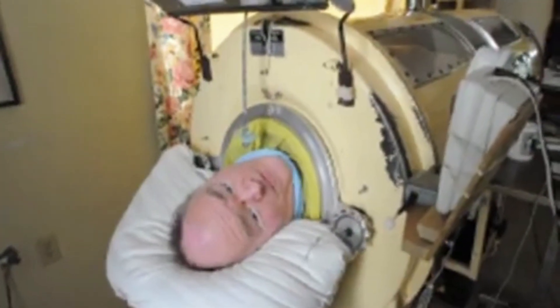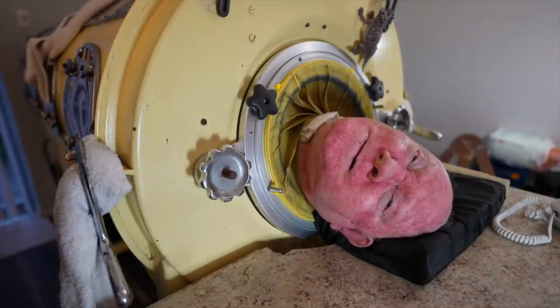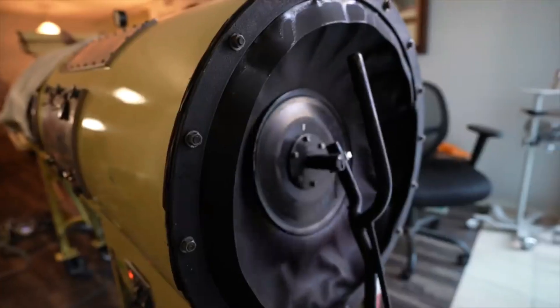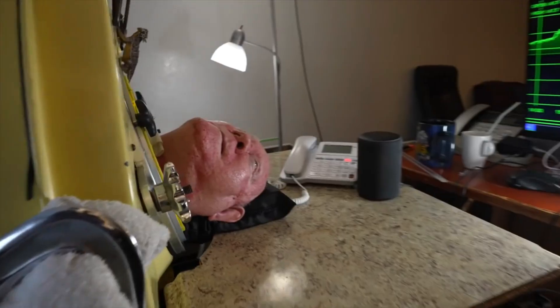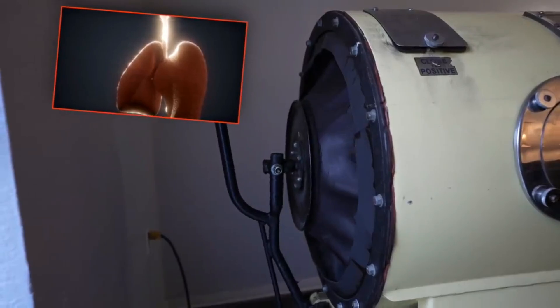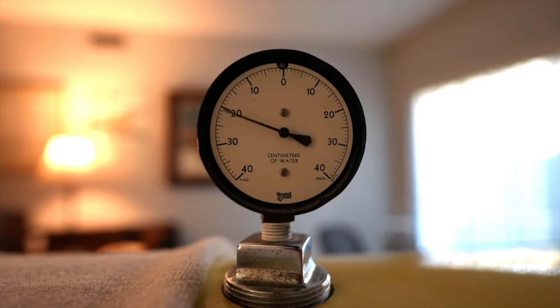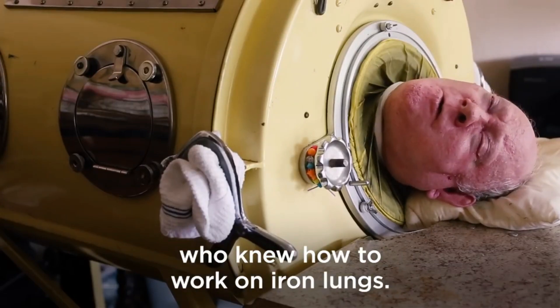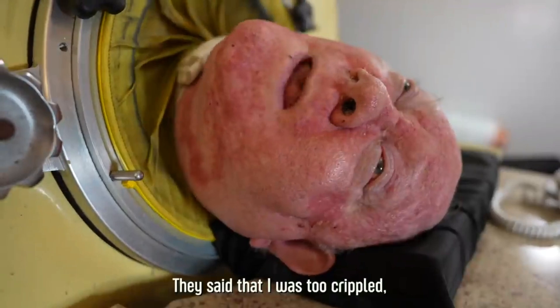Inside the iron lung, a patient's body is sealed up to the neck, with only their head sticking out of the top. The pump creates a vacuum inside the chamber, which causes the patient's chest to expand, drawing air into their lungs. When the pump is turned off, the pressure inside the chamber returns to normal, causing the patient's chest to relax and air to be expelled from the lungs. This simple yet effective mechanism allowed thousands of people with polio to breathe when their respiratory muscles were paralyzed.